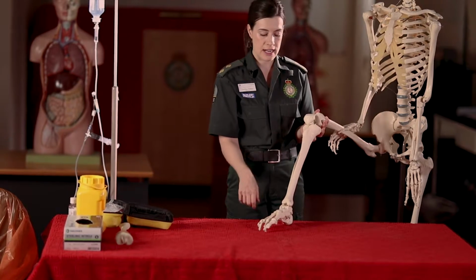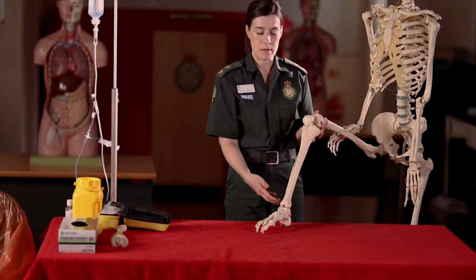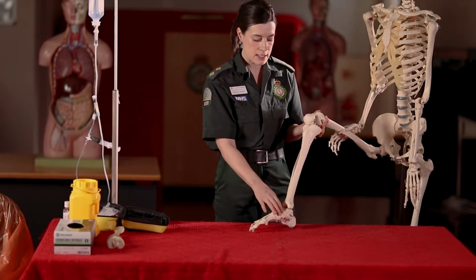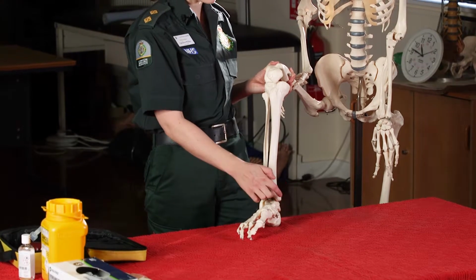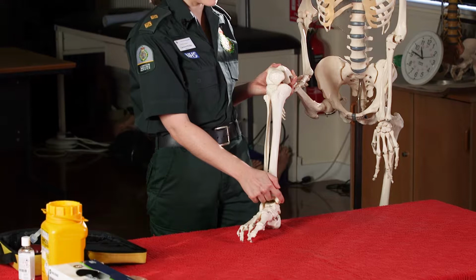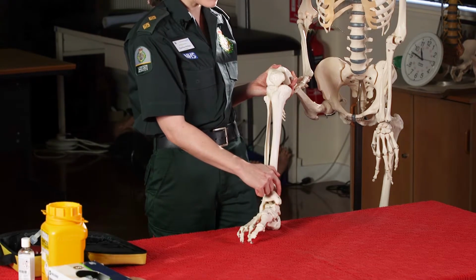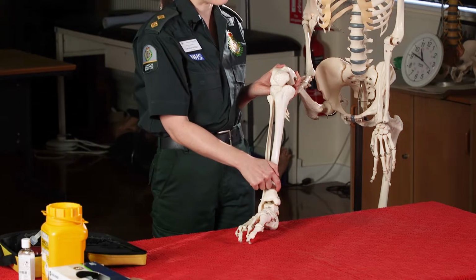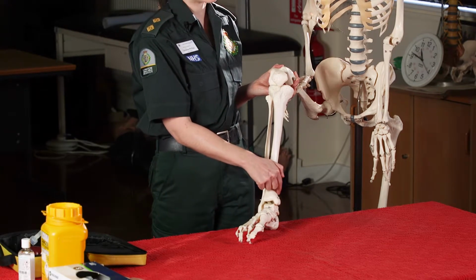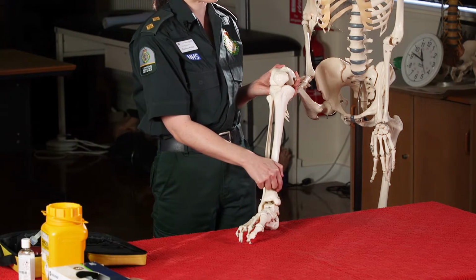The third option that I have is the distal tibia. To locate this site, I will find the medial malleolus, so the prominent ankle bone on the inside of the patient's leg, and come 3 centimetres up the tibia, still on the inside of the leg, and this is where my distal tibia site is.